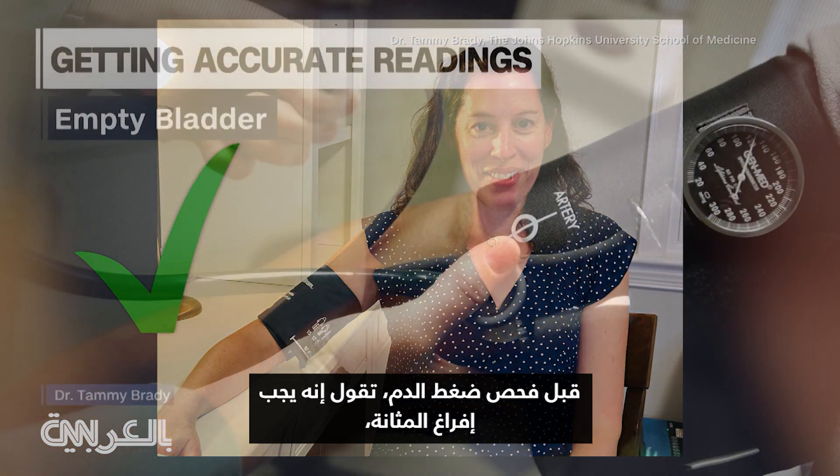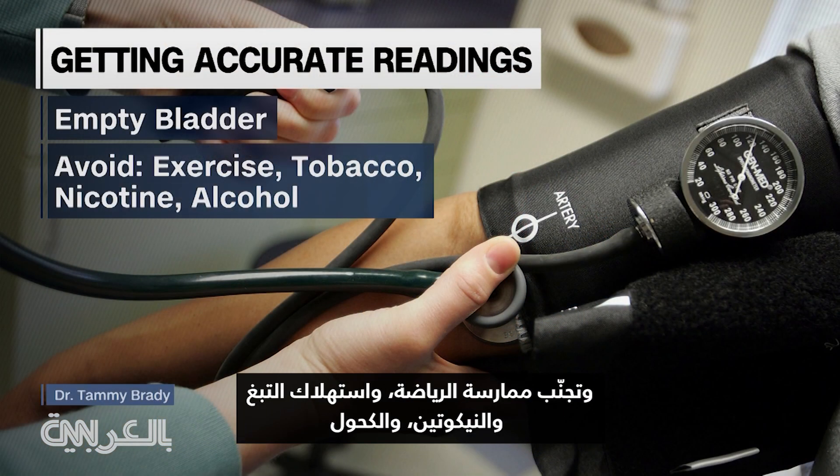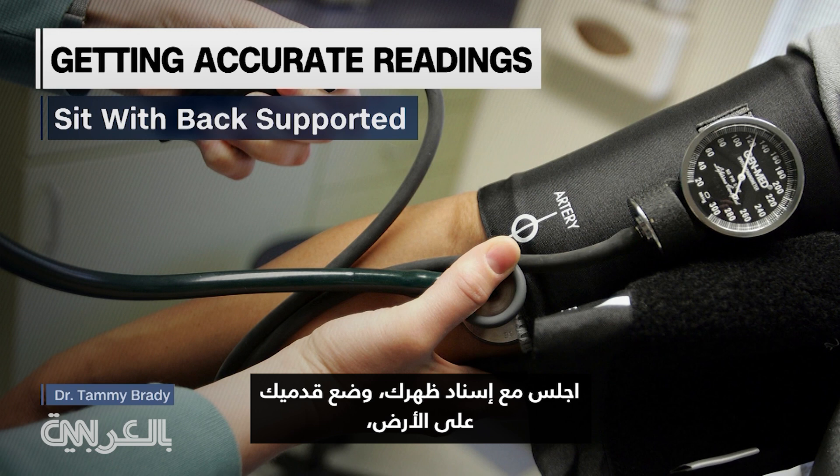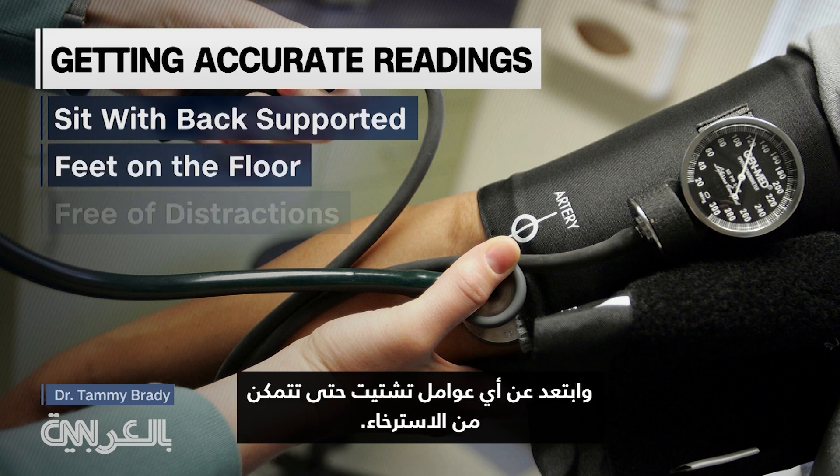Before the blood pressure is checked, she says to empty your bladder. Avoid exercise, tobacco, nicotine, and alcohol for at least 30 minutes beforehand. Sit with your back supported, feet on the floor, and be free of distractions so that you can relax.